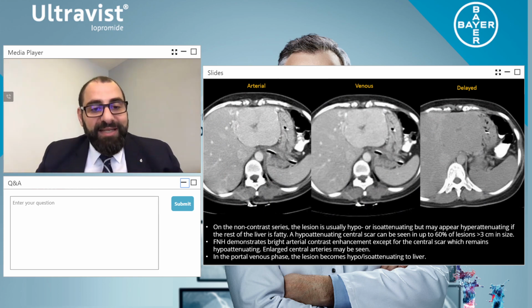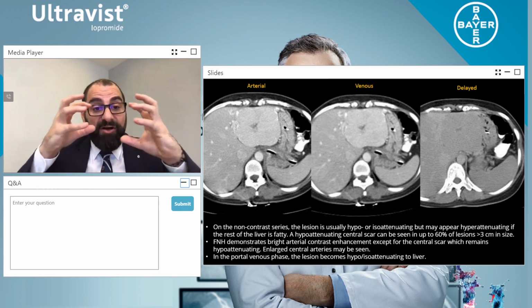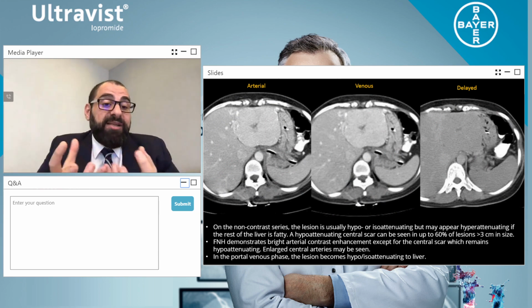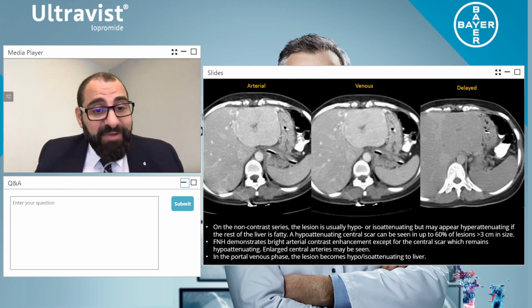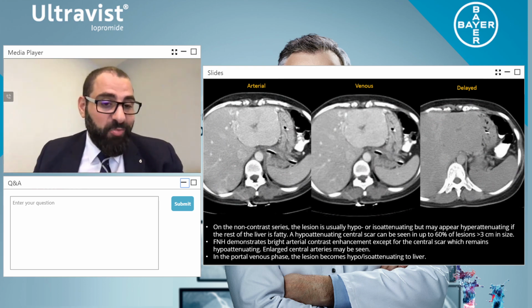Cancerous lesions, which are malignant, love to recruit large and small blood vessels to increase the nutrients in there, but they also like to kill themselves internally so they can reuse those nutrients to keep growing. So when we're looking at liver imaging and malignant tumors, we're looking at the wall of the lesion, what happens there. And we have talked about that with the enhancement pattern.